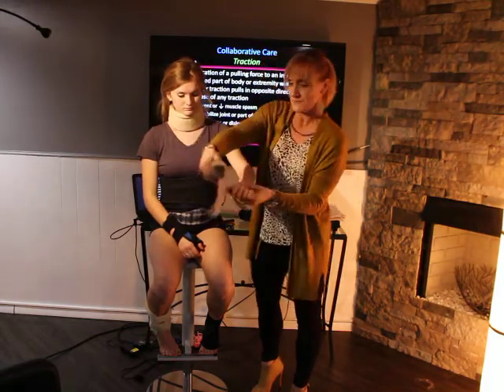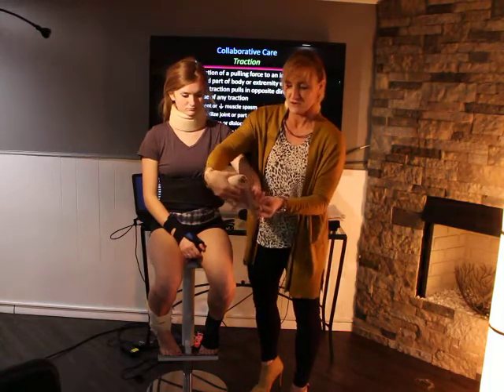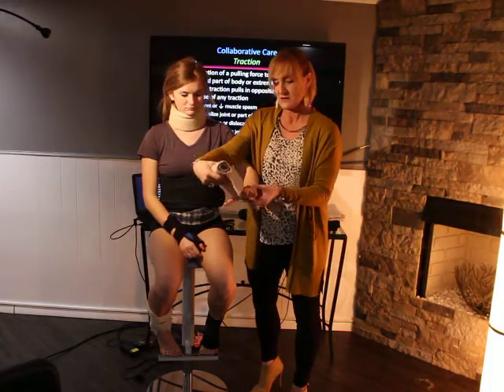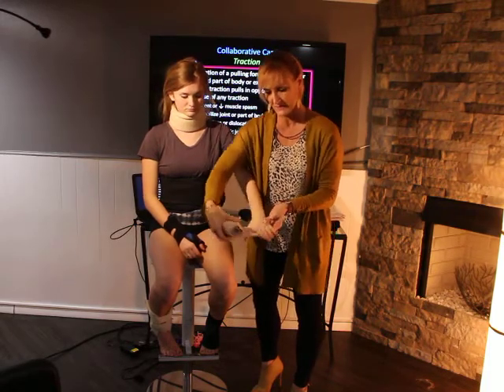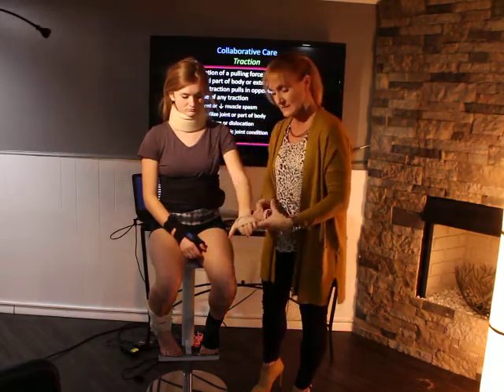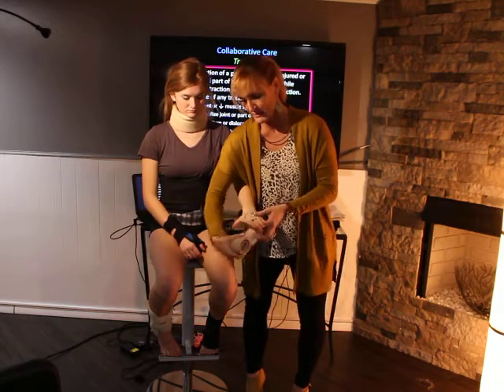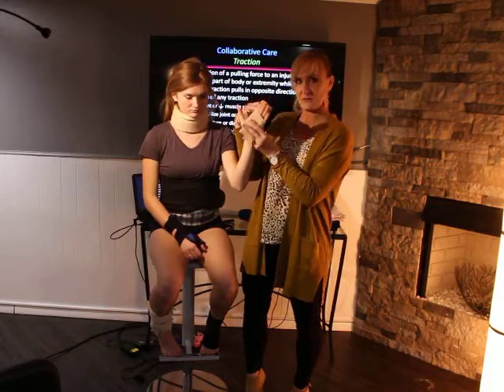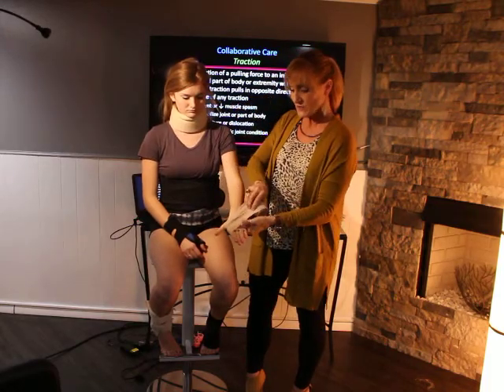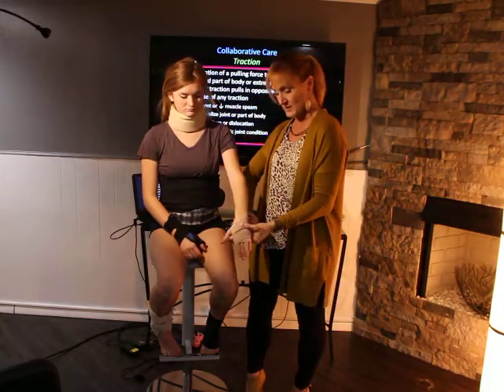So you're going to start this right here, and you're going to hold your fingers on her palm like that, and you're going to want to go in on this thumb. You're going to come around, and the easiest thing to do is double it back on itself, like that. So now you've got an anchor. So you've just anchored it in place right there, okay? So then what you're gonna start doing is you're gonna wrap it up.